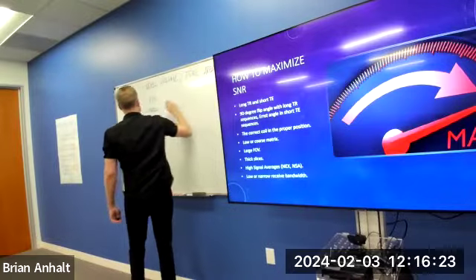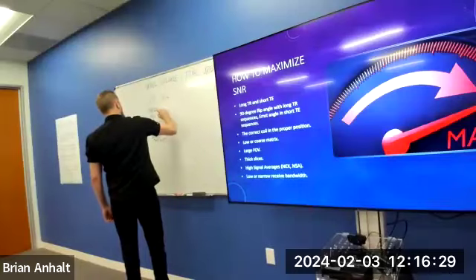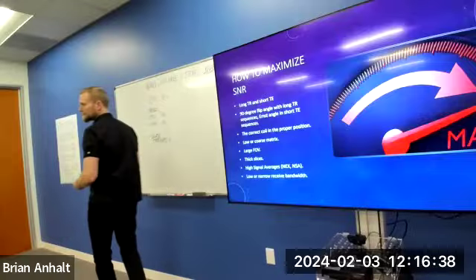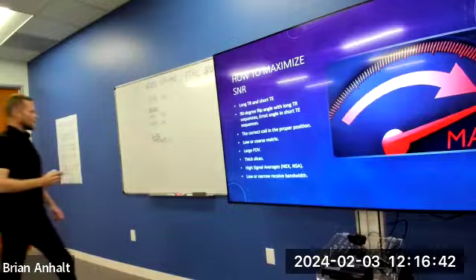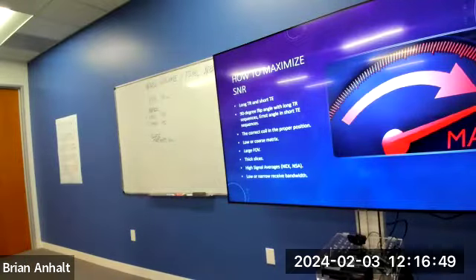So let's say I have a field of view of 30 centimeters. I have a frequency matrix of 320 and a phase matrix of 192 and a slice thickness of 6. Slice thickness is always going to be in millimeters. So if your field of view is in centimeters, you want to get the units the same. You want to have the same units to do this type of math.